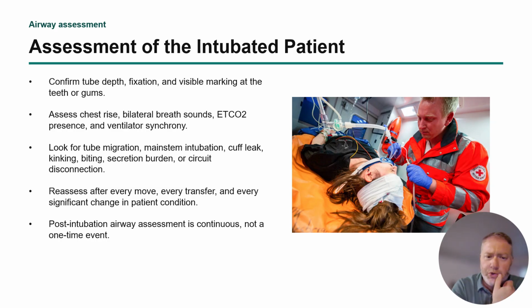So I'm not sure what the medic program tells you about endotracheal tube cuffs and cuff leaks and things like that. But typically we put about 10 mLs of air into the cuff, and then we check it with a cufflator or some sort of cuff manometer to make sure that it is at a safe level.